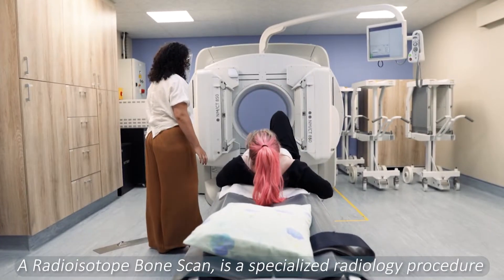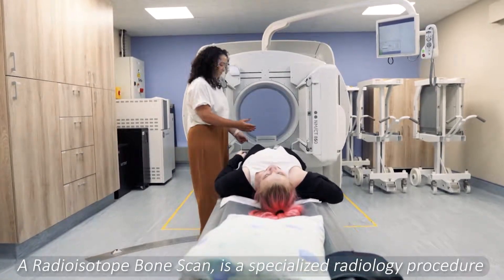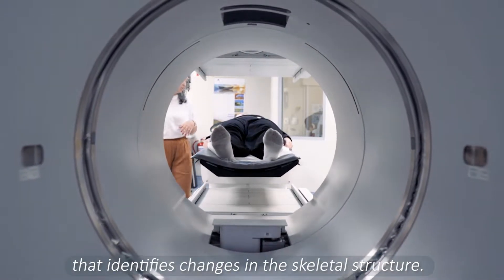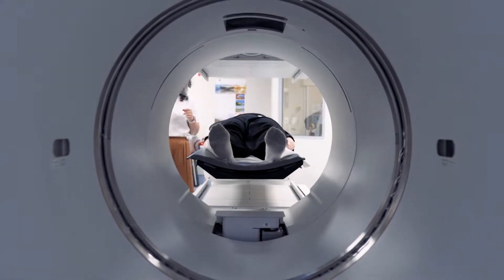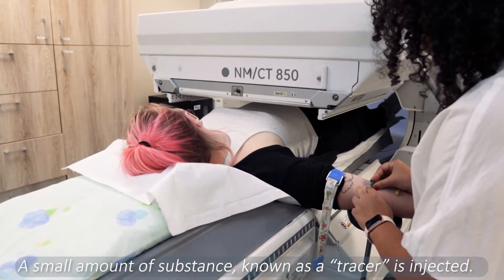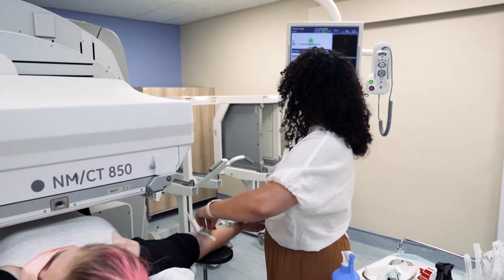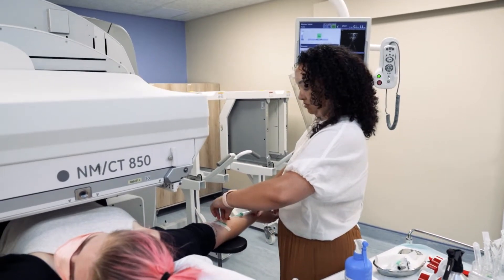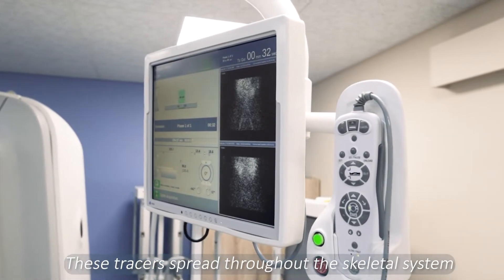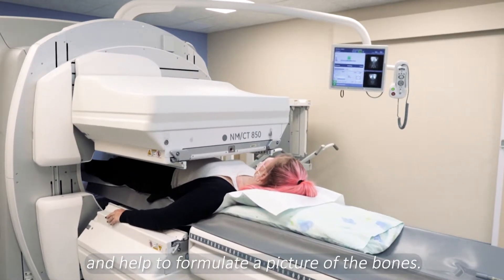A radioisotope bone scan is a specialized radiology procedure that identifies changes in the skeletal structure. A small amount of substance known as a tracer is injected. These tracers spread throughout the skeletal system and help to formulate a picture of the bones.